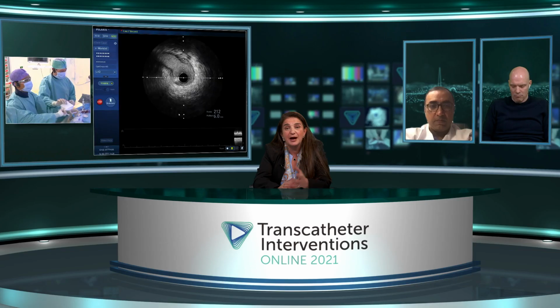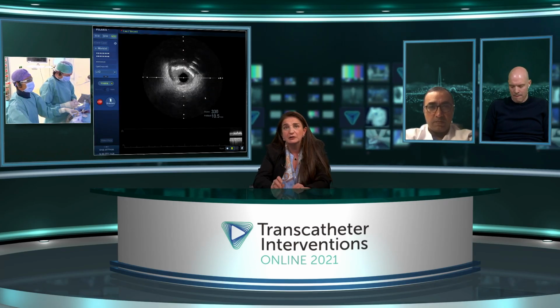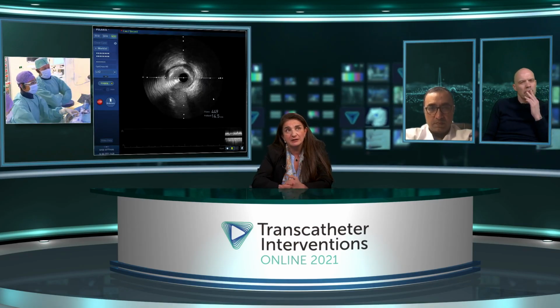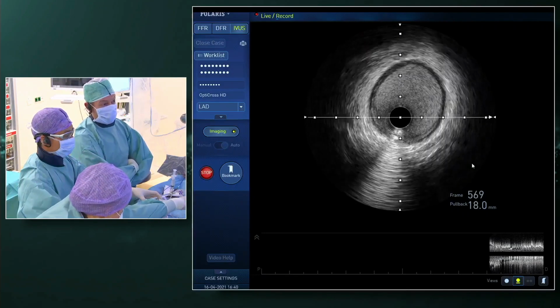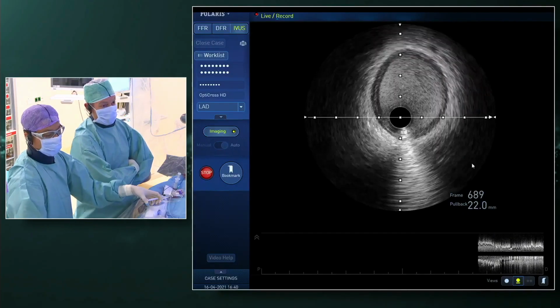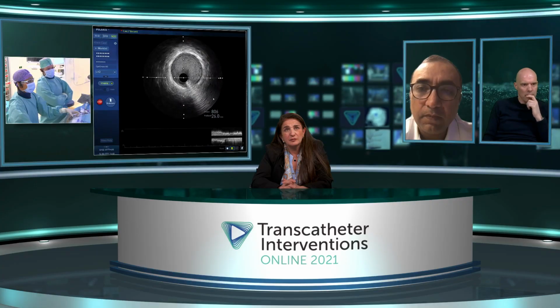So you'll see how this is going to work. I mean, I think Joost did a beautiful job. He was very methodical. Went back and forth several times, and I think he felt, and you're going to see the break of the calcium here as you'll observe on IVUS. It'll be very telling. So we are in the mid part now.